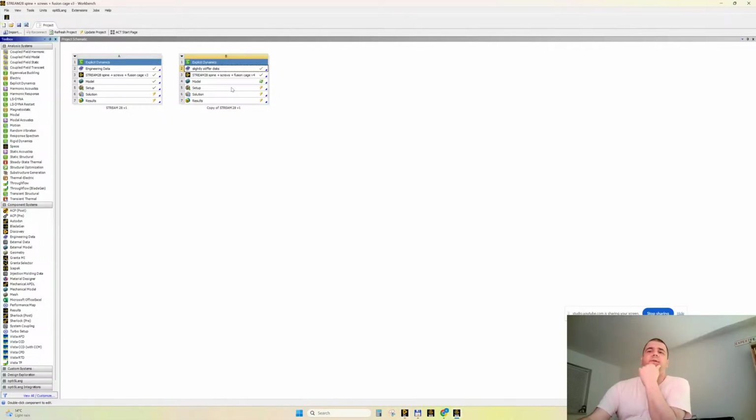All right. Double click. I keep space claim in order for the geometry to be updated faster.